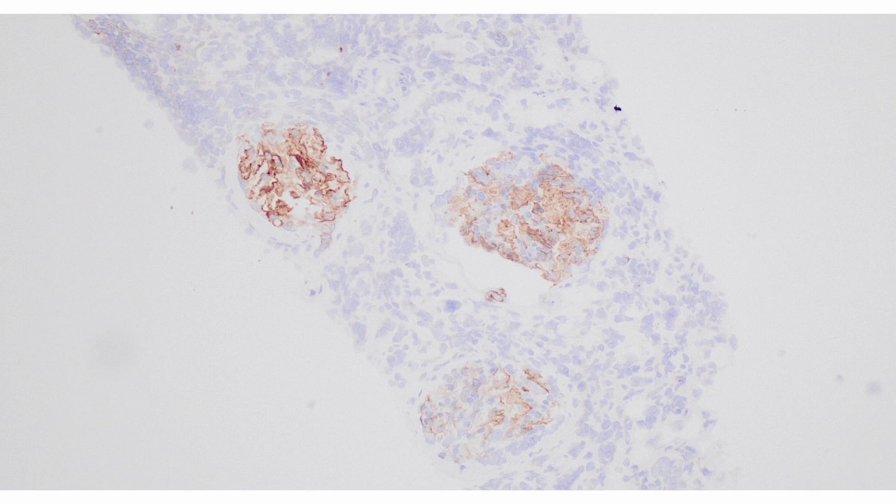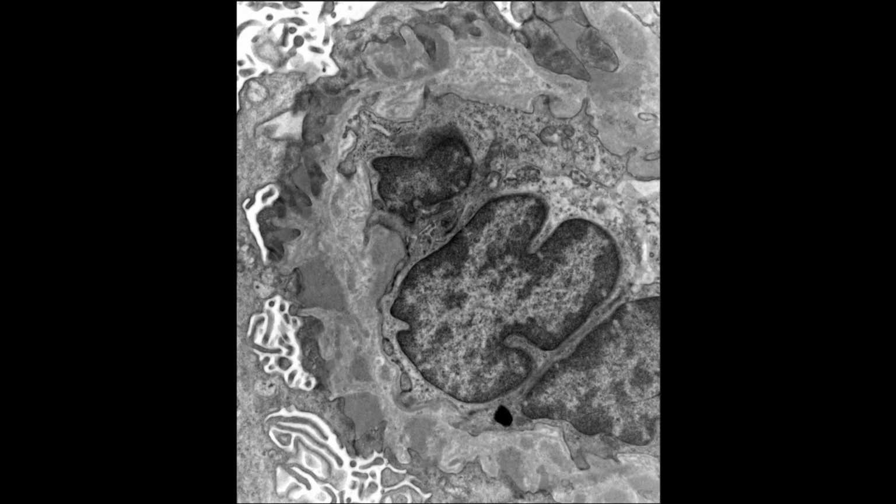Were there any findings or deposits by electron microscopy? So our electron microscopy did show that there were some subepithelial deposits, which went along with our diagnosis of membranous glomerulopathy. There were no subendothelial deposits. There were some rare mesangial deposits. So you have multiple findings here. What was your final diagnosis?